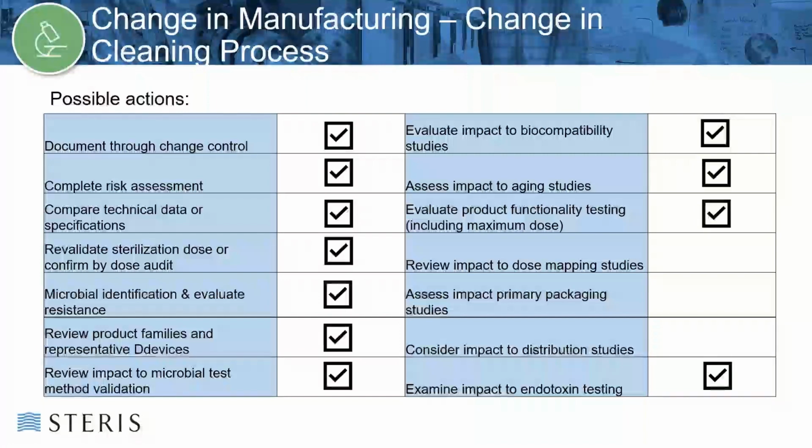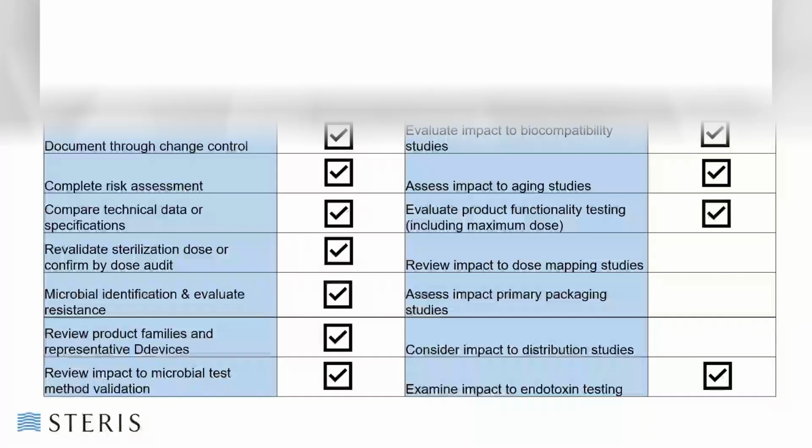And then those items outside of the irradiation validation could be an impact to product functionality and or aging. Consideration to biocompatibility testing, and also considering the impact of cleaning changes to endotoxins found on the device for those devices that have endotoxin requirements.